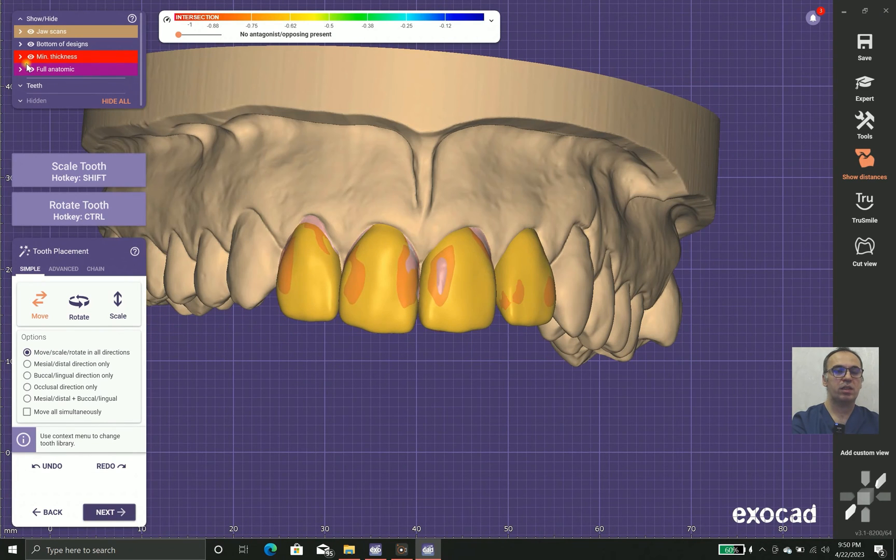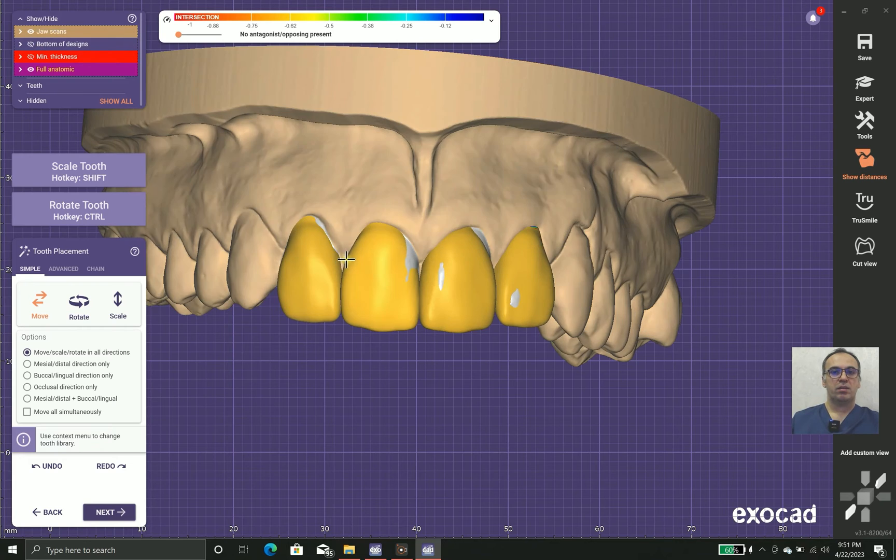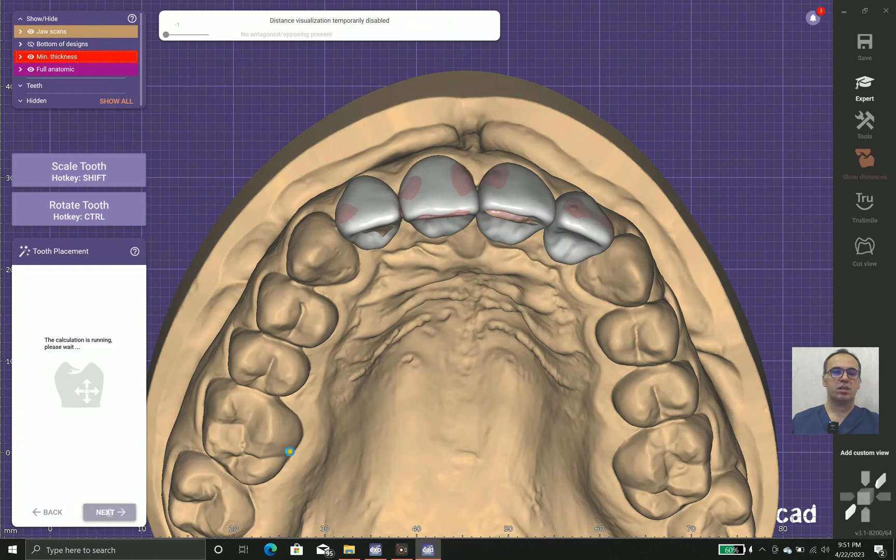Now we turn off the cast and check minimum thickness and tooth alignment. We can see the alignments are not good, so we change the alignment for better results. Step by step, the teeth get into better position, and when we finish positioning, we let the software calculate how it should look.